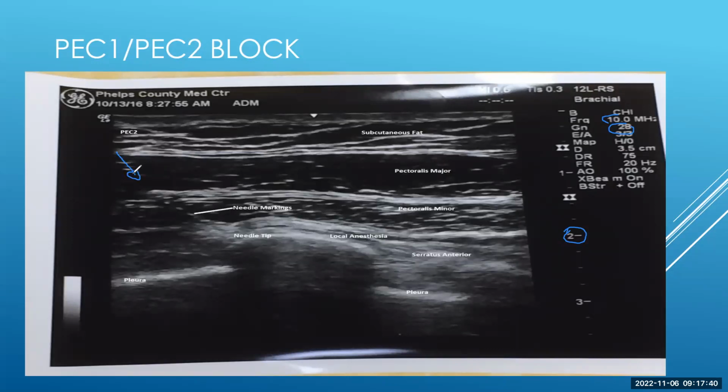It's just where the ultrasound probe was placed, and then those sound waves crossed at that level. It can be a little misleading, so several companies have put these little notches on there to help us decide where exactly the tip of the needle is.